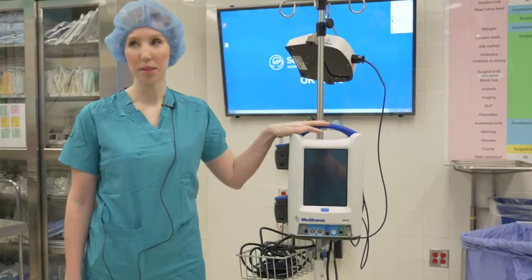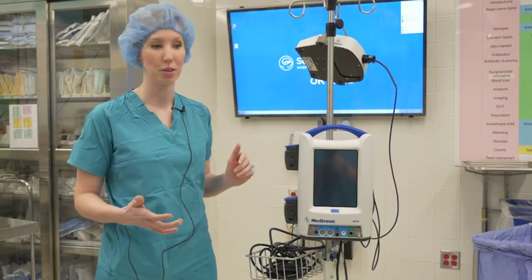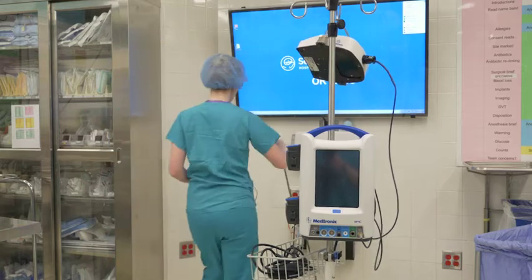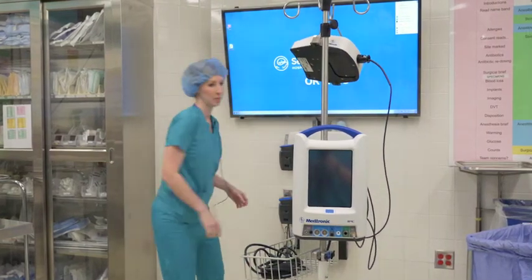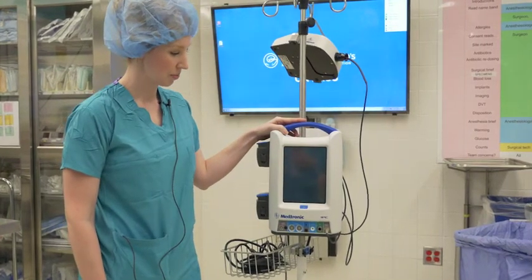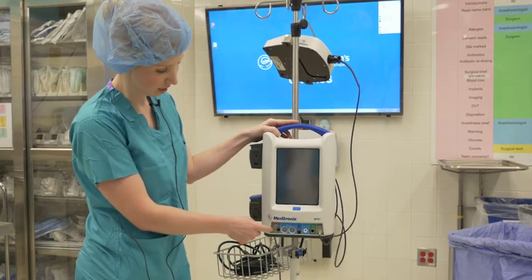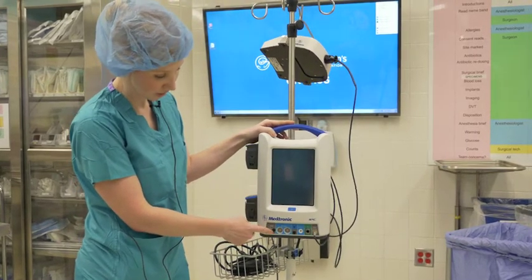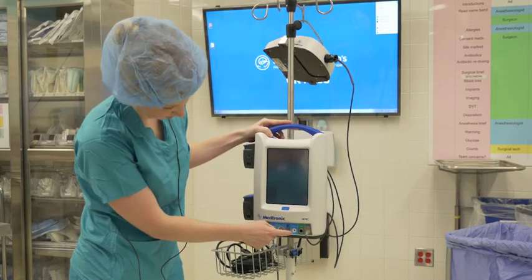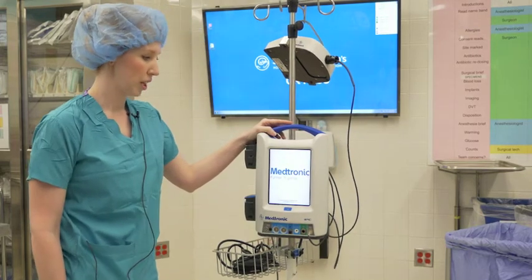Okay, so guys, this is the Medtronic console, and I'm going to show you its features and how to prime the tubing specifically. So with every piece of electronic equipment, plug it in first. And this is the on switch right here. Let it power up. And this console accommodates a variety of equipment. The Midas Rex plugs in here. It accommodates 2 sinus shavers, the Skeeter drill, and the endo scrub. So we'll let it boot.